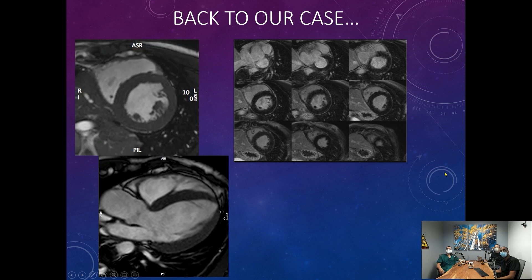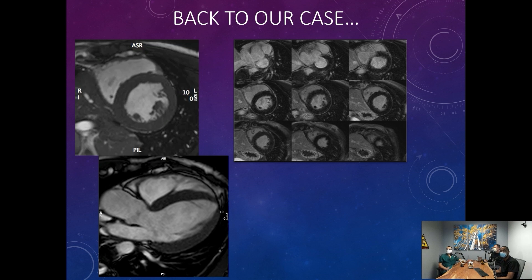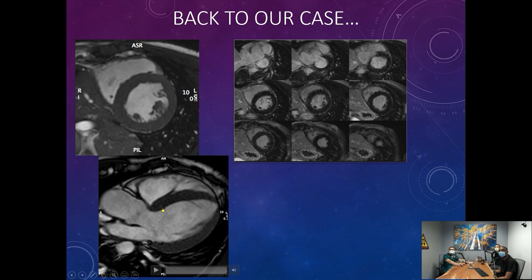Returning to our young man — we administered gadolinium and found that in the LGE sequences there wasn't much to write home about. Maybe a slight signal at the septum, so we haven't quite ruled out HCM. Another thing I look at: in genetic hypertrophic cardiomyopathy the hypertrophy tends to be a little more asymmetric, whereas here it's fairly symmetrical. We can also look at septal curvature — here it's concave, curving outward, whereas in genetic HCM it tends to be convex and bulge inward.